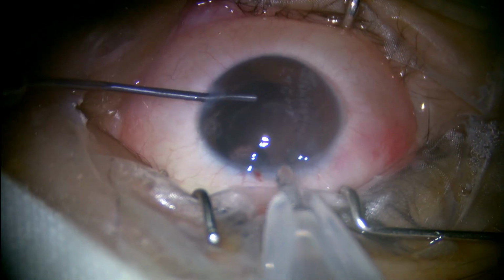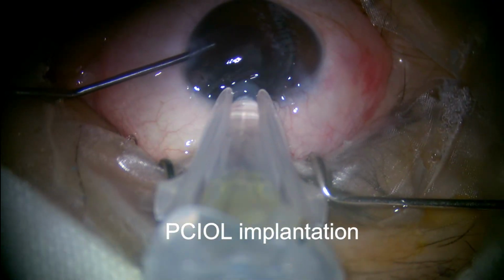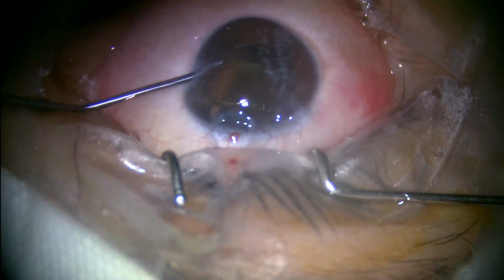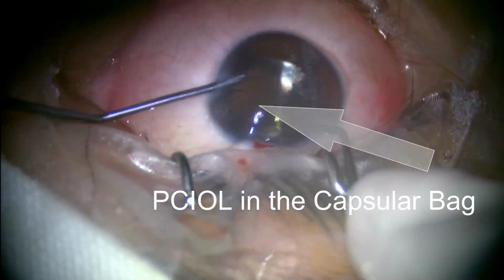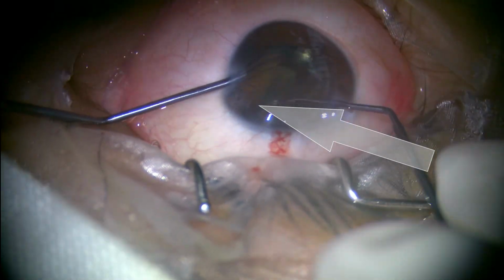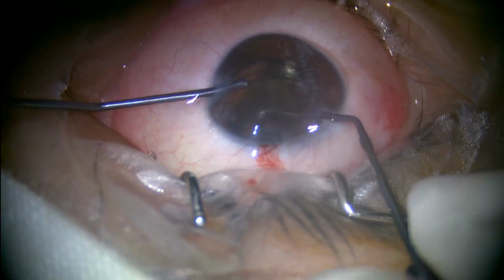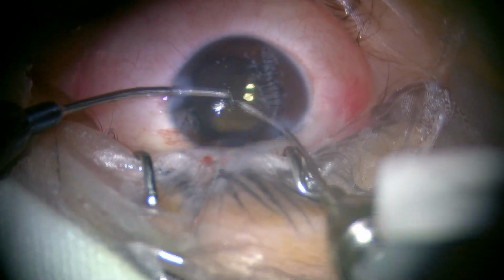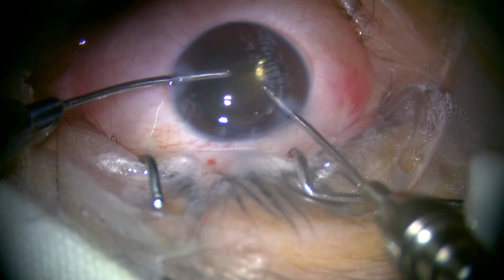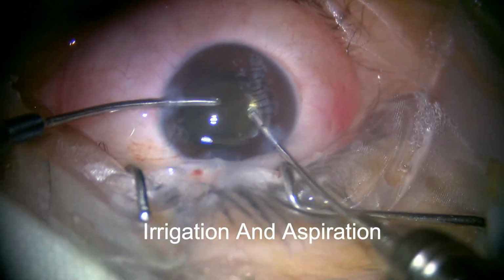Now, the preloaded hydrophobic posterior chamber intraocular lens is being implanted in the capsular bag. Proper centration of intraocular lens is being ensured. All the remaining viscoelastic substance is being aspirated by bimanual irrigation and aspiration.